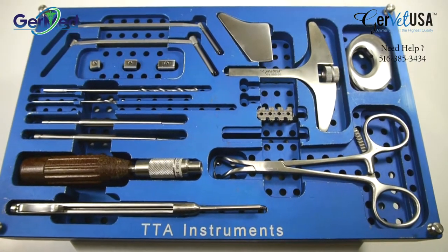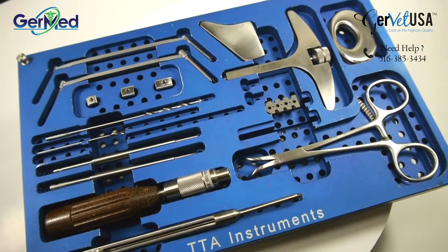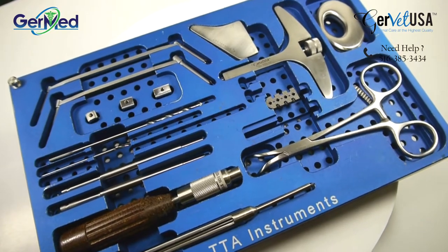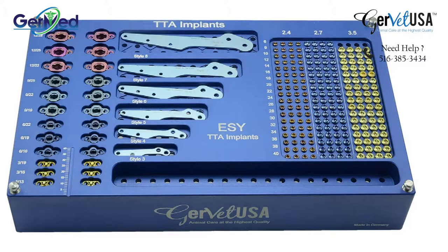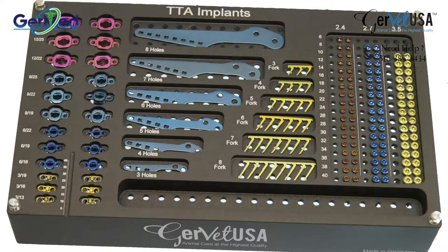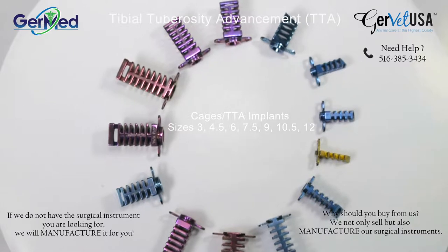Tibial Tuberosity Advancement, or TTA instruments, provide cranial cruciate ligament repair in dogs. This procedure involves dissecting the front of the tibia bone and moving the cut portion forward, which reduces abnormal sliding in knee joints. TTA implants and instrumentation are the most commonly used in cruciate repair. It serves as a fairly simple procedure and gives the dog a quicker recovery time.